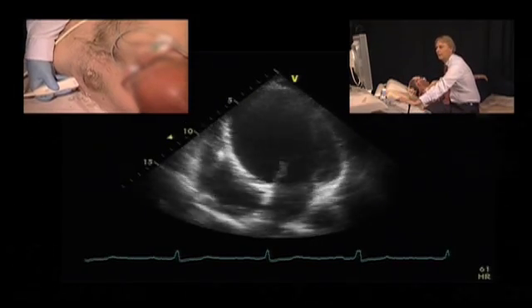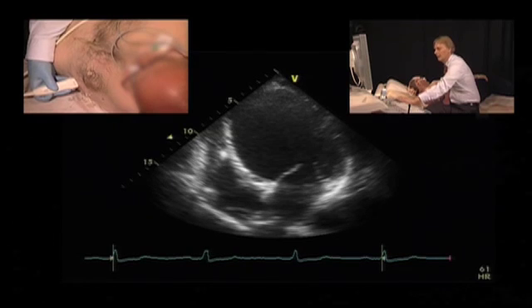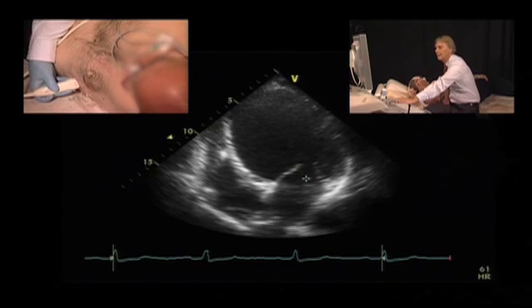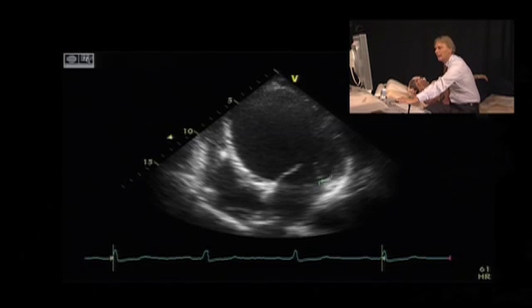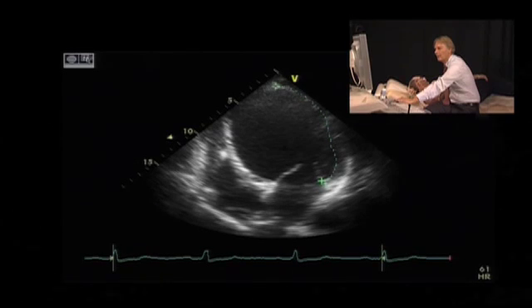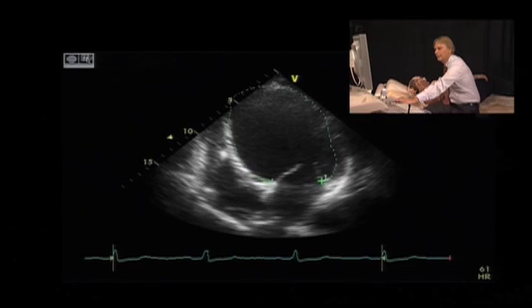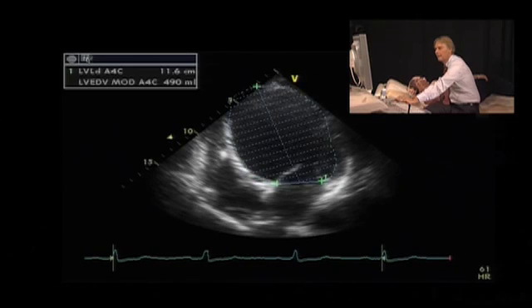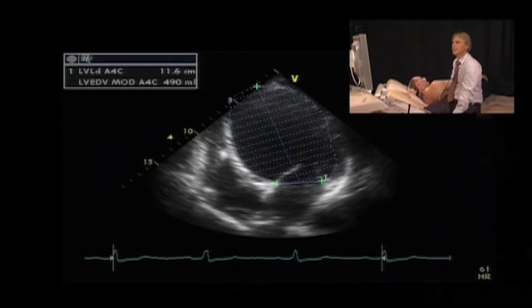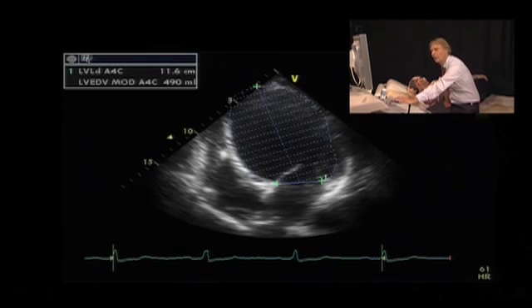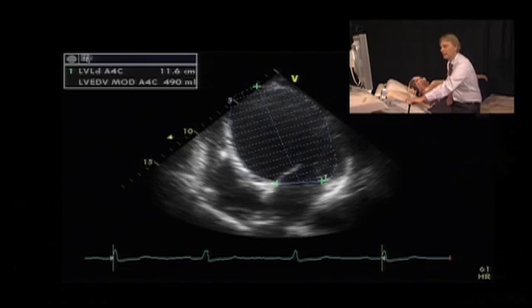I would then freeze the image and trace the endocardial contour in diastole. The problem is that the ventricle is so large that it cannot be imaged in the sector, so I'll have to cheat a bit here. Nevertheless, I would get an end diastolic volume of 490, so almost 500 milliliters, in the four-chamber view.